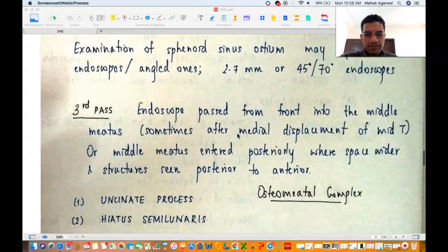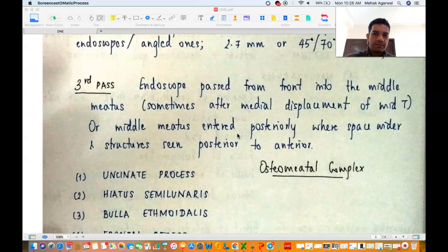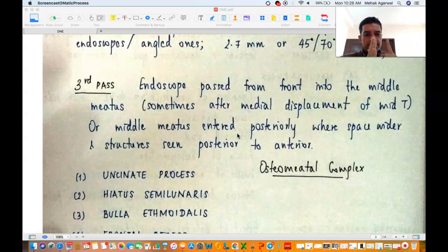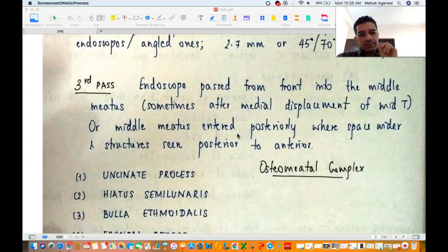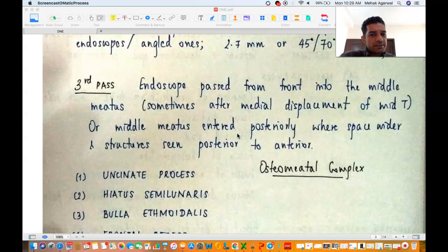The third pass is the most important pass. The endoscope is passed from the front into the middle meatus. For this, you may have to displace the middle turbinate slightly medially — the anterior part of the middle turbinate is displaced slightly medially, very carefully and not roughly, because rocking the turbinate might cause a serious CSF leak. You then put your endoscope lateral to the middle turbinate and examine the middle meatus. Alternatively, you can insert the endoscope into the middle meatus from the posterior part of the middle turbinate where the space is wider.